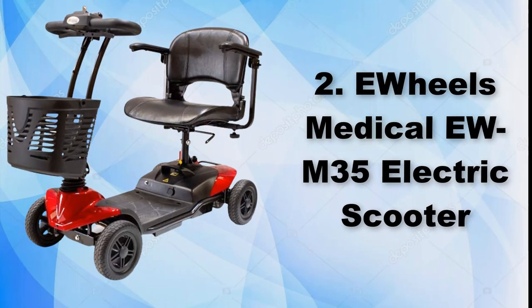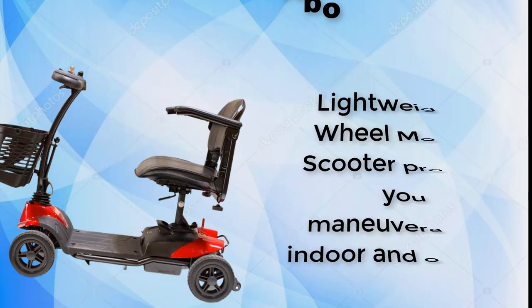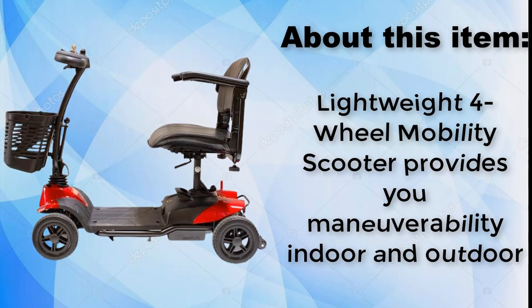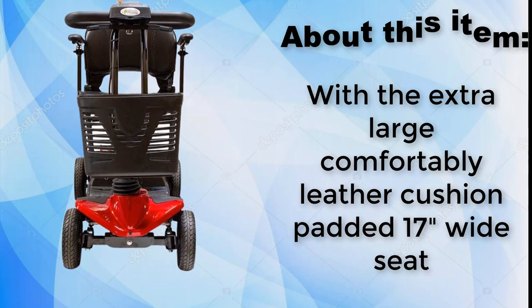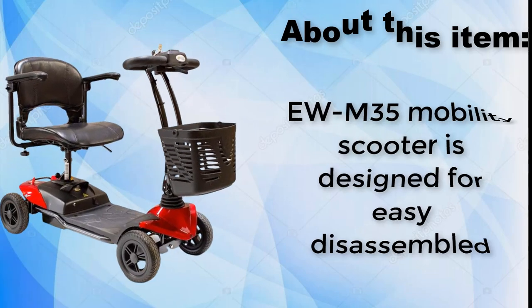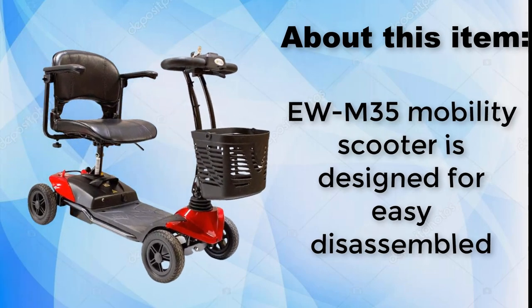E-Wheels Medical EW-M35 Electric Scooter. Lightweight 4-wheel mobility scooter provides maneuverability indoors and outdoors. With the extra large, comfortably leather cushion padded 17-inch wide seat, the EW-M35 Mobility Scooter is designed for easy disassembly.